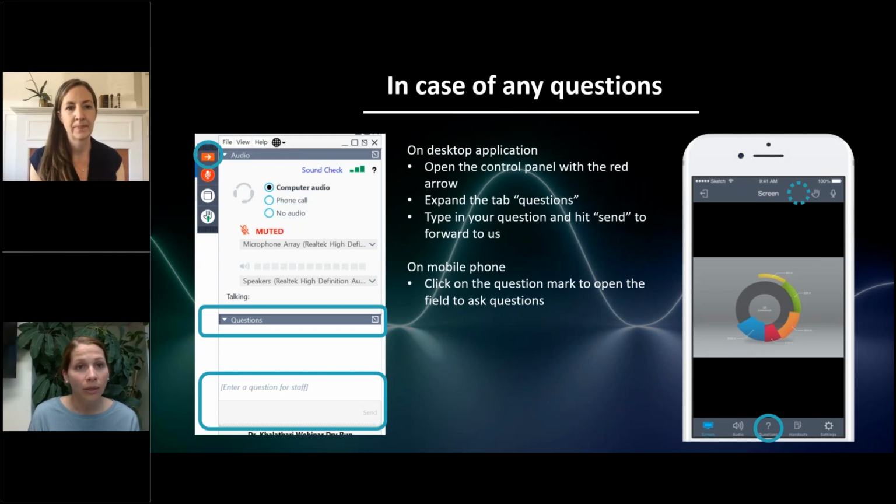Great, thank you. The next question is, traditionally pattern ERG has been used to evaluate ganglion cell function. How do you see the possibility of photopic negative response replacing pattern ERG? So that's an excellent point. So the pattern ERG has traditionally been the electrophysiological test to isolate the optic nerve. The challenge with pattern ERG for my clinical interest of IIH is that vision loss from IIH occurs from the outside in. And so my concern was that pattern ERG, which typically flashes the pattern in a smaller central region of field, would not capture that particular ganglion cell dysfunction.